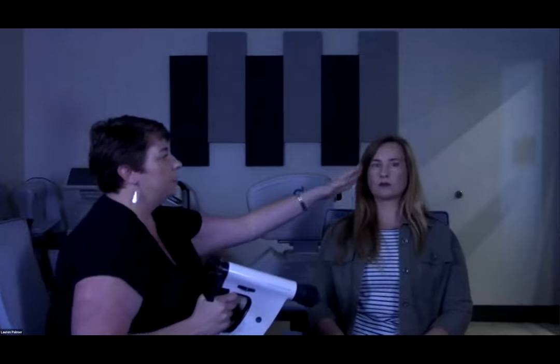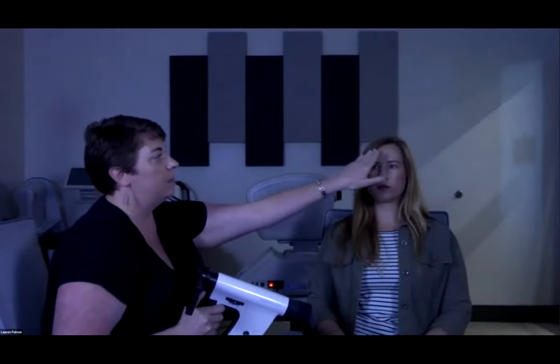Before you put that away, we had a question to review the angle with the Remedio camera again. Absolutely. If you'd like to do that as well. Okay. So as I mentioned earlier, coming at about a 30 degree angle is very helpful. So you want to have your patients facing forward and looking at the angle to the side so that their pupil is isolated and you can align with it properly. And so when I'm approaching Rebecca, I'm going to place my supporting hand on her temple. And again, you may be placing your hand on their forehead, depending on which eye you're taking a picture of and which hand you're holding the camera in.